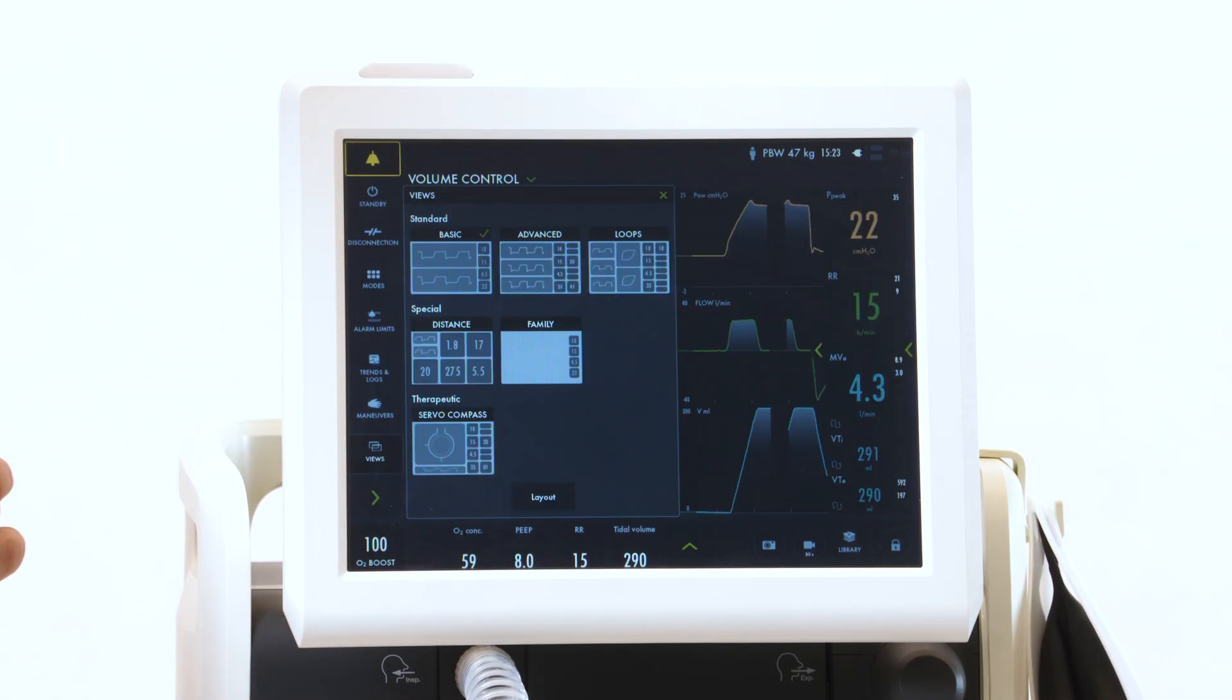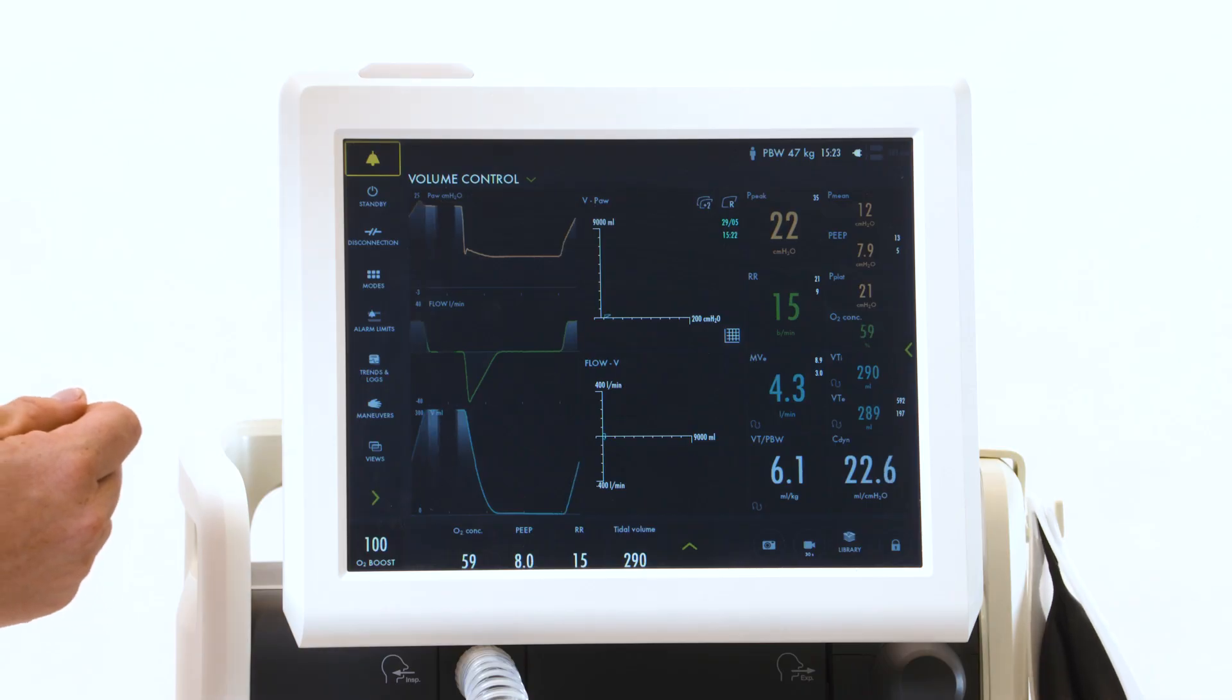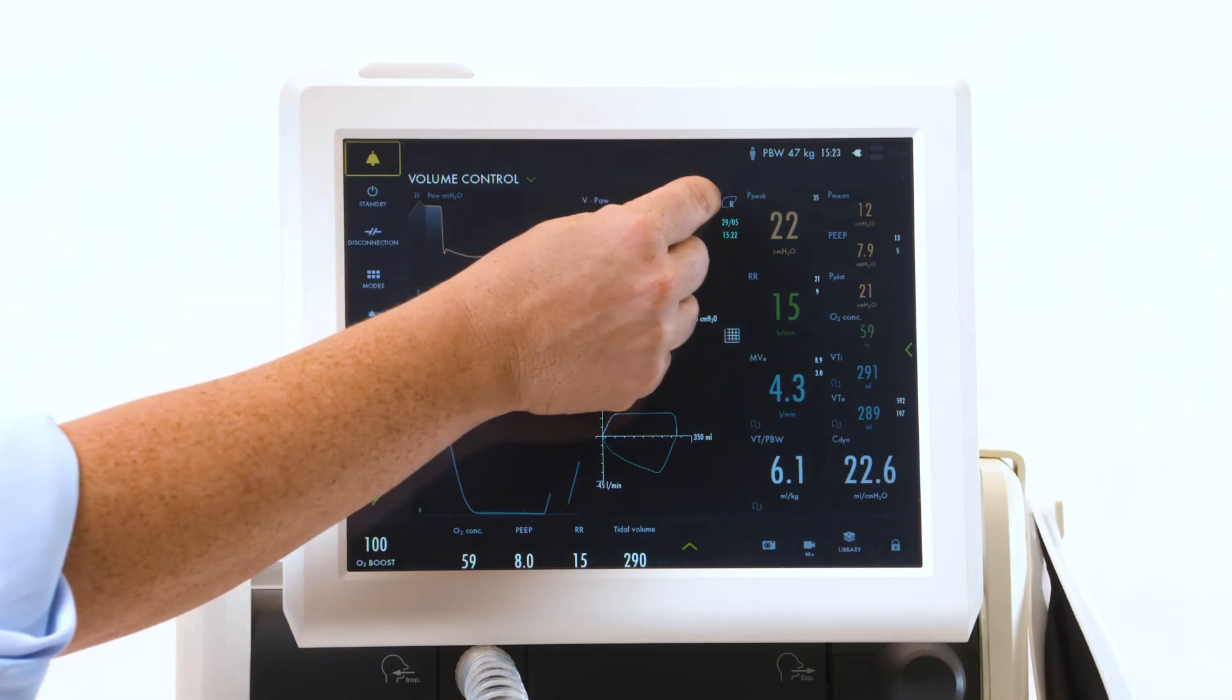Looking again at your views, you have a loop screen. Your loop screen will show your loops, which you can also have reference loops noted up here. Just touch to activate.